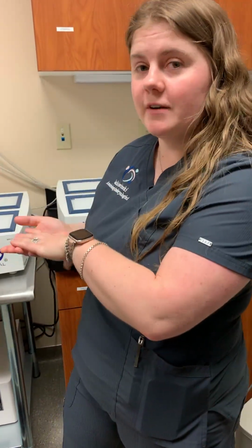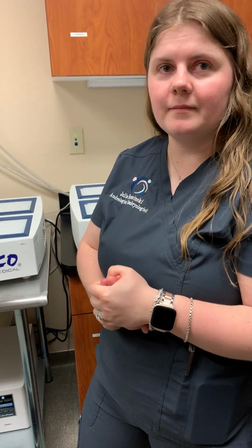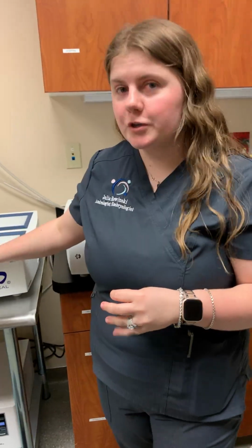That is optimized for our culture media that our lab uses. There's multiple options that we have out there, and what you're doing is you're aiming for a certain pH, so a certain acidity level, of your medias. I ran these tests this week where we put media in that is our newest lot. We locked it in for at least 14 hours. It can be a little bit longer as well, and then we check it to make sure it's coming up correctly at the most optimal level that the company has told us will operate for us.